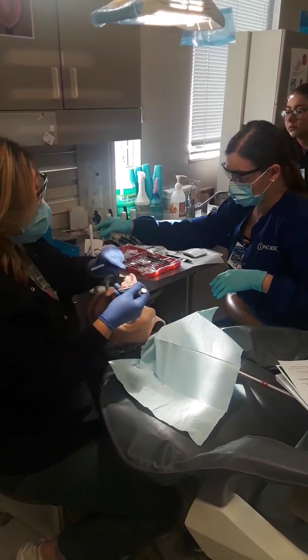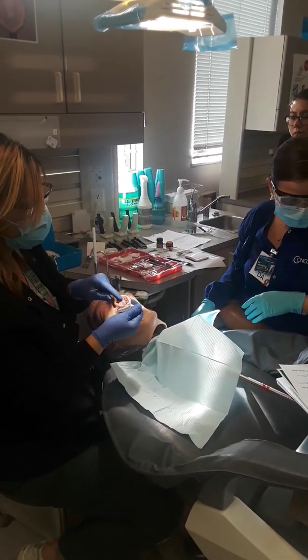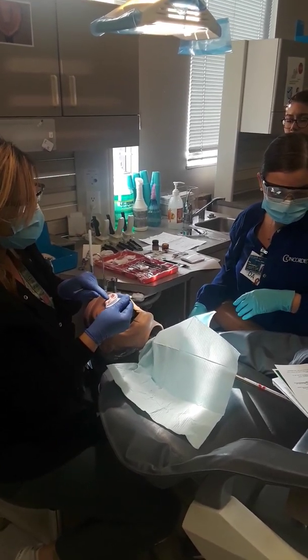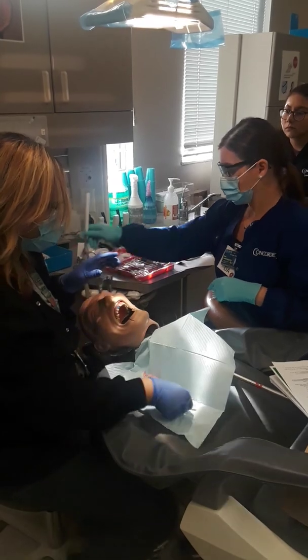Okay, material's hard. Now the doctor is going to look at the impression to make sure we got everything we need. We can see clear margins. We can see the tooth. I have a really good one I want to show you. So while she rinses, I'm going to find that.